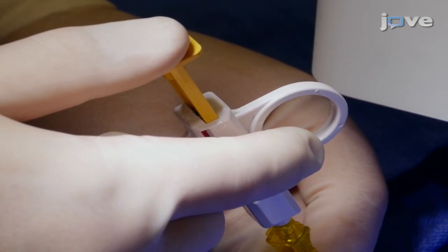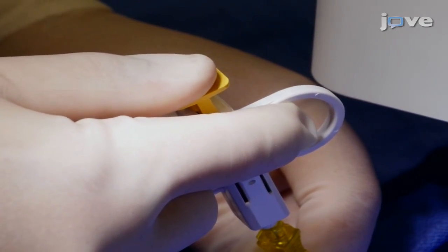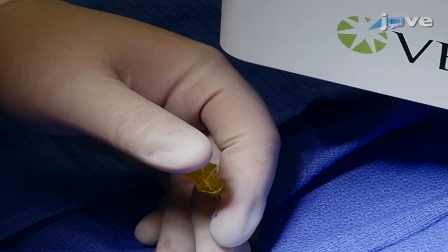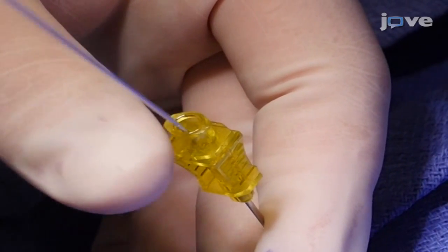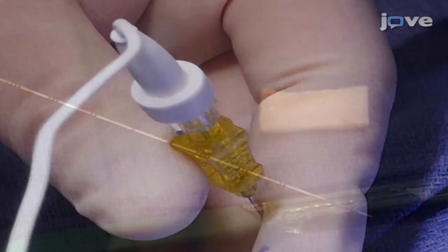Stabilize both the needle and biopsy gun, trigger the needle biopsy gun mechanism to perform the biopsy, then remove the gun from the electromagnetic navigational guide needle, making sure it remains in the appropriate position. Now, gently advance the guidance probe back into the lumen of the percutaneous needle and keep it stable.